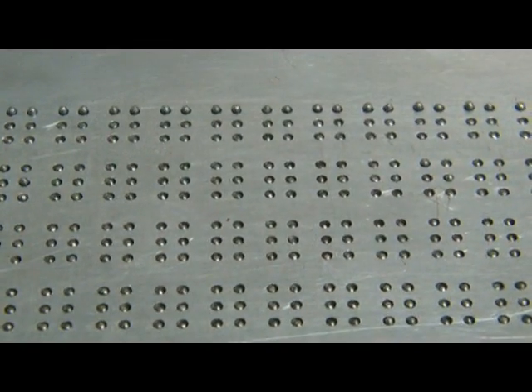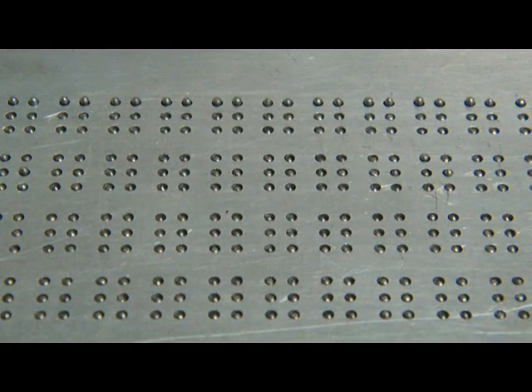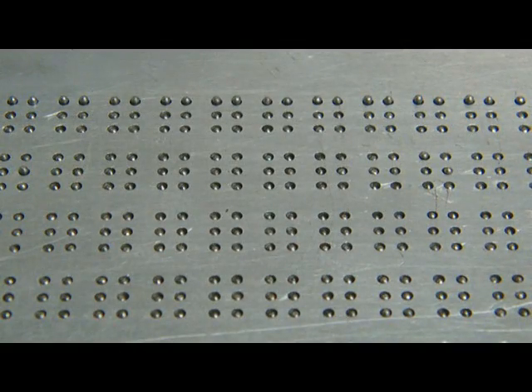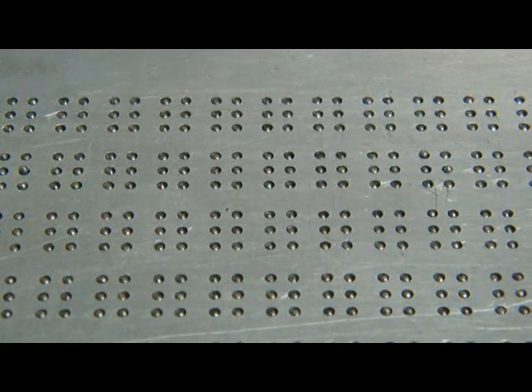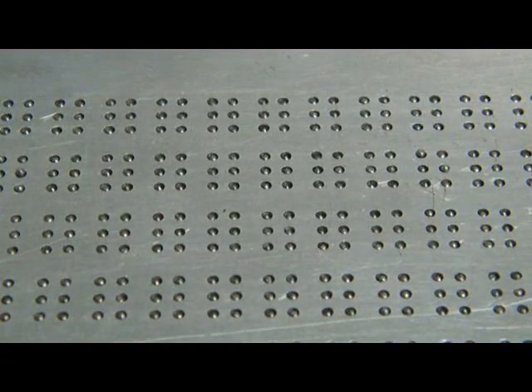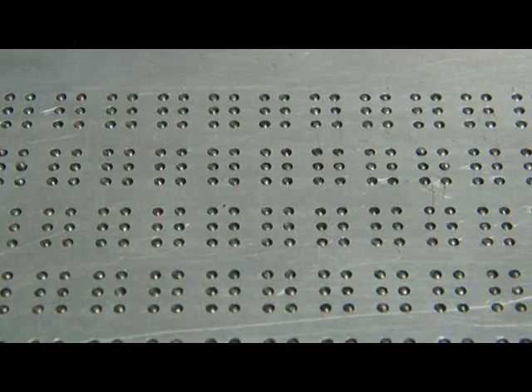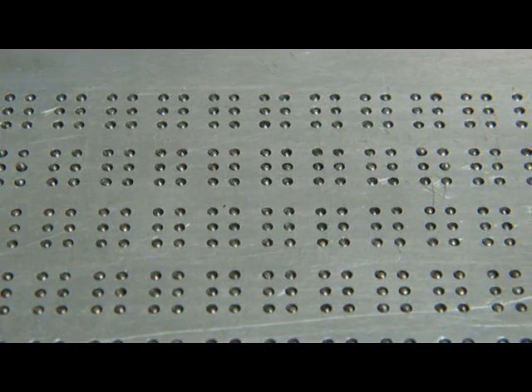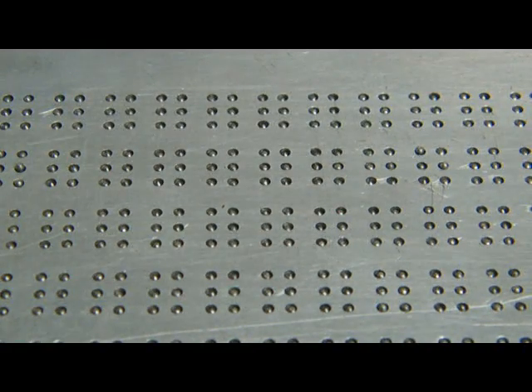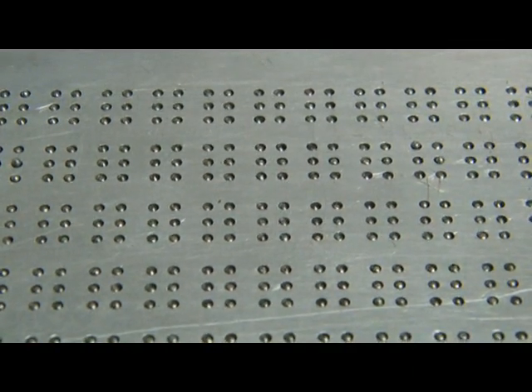Now what I've used in this case is NOT logic. That is, all the columns are enabled, and that way I can trigger the entire row of pins at a time. In actual practice, all the columns would be disabled, and only the column that is being set with data would be enabled.